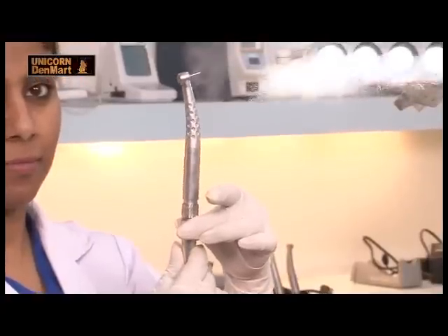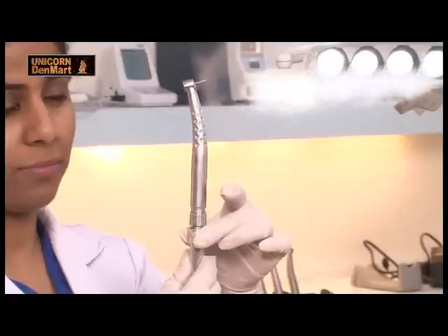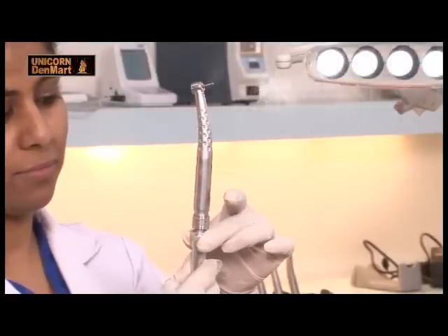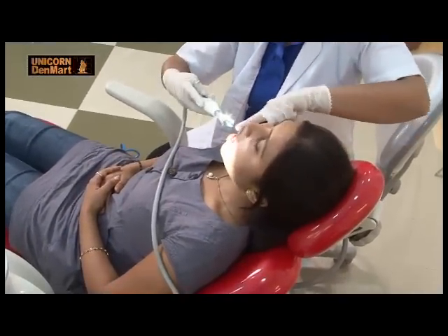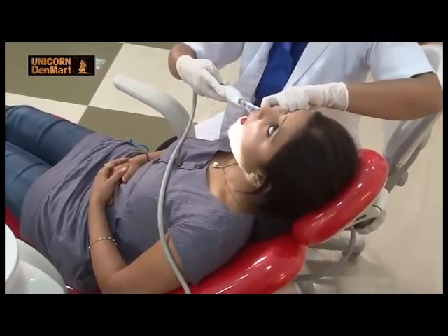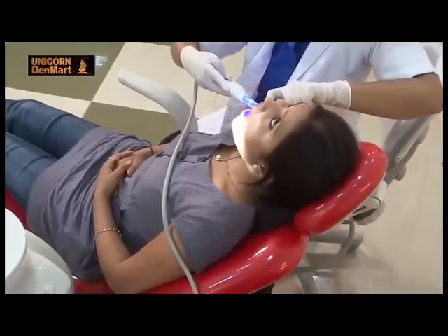Water control is on the handpiece coupling for increasing as well as decreasing the flow of water through the handpiece. Equipped with OptiLite LD Maxx LED light cure, this unit helps in curing of resin-based tooth fillings and bleaching teeth for aesthetics.